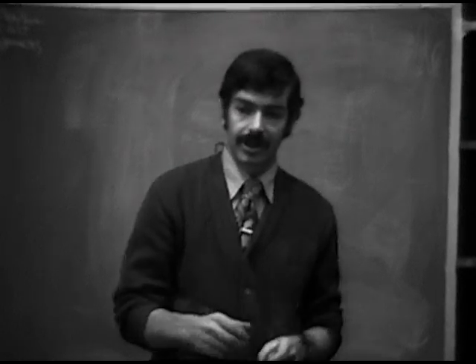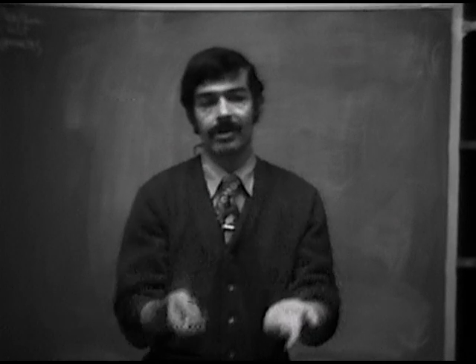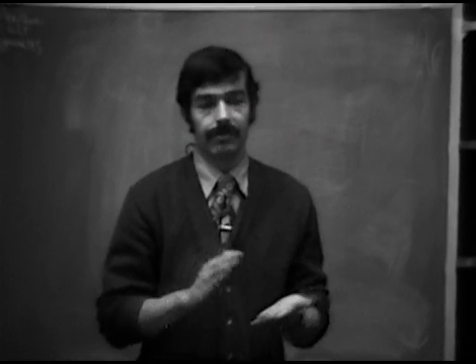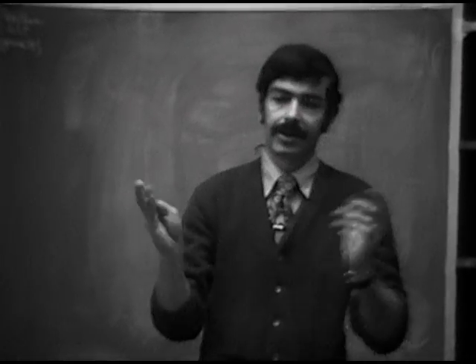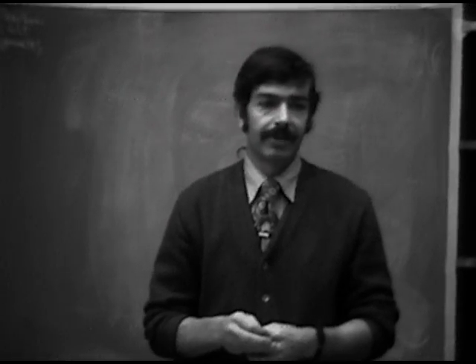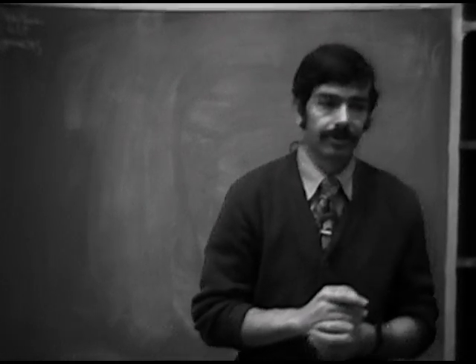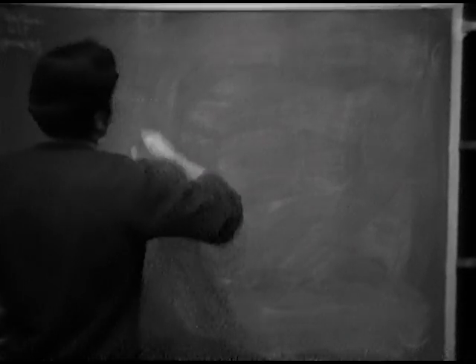Whereas if they would just take the time and go through a routine that we're going to describe, things would automatically pop out at them, and they would have a diagnosis. Also, other people have a tendency to see an inferior MI and then throw the tracing away, and they forget about noticing the first-degree block and other things, which can be extremely important. So for many reasons, it's important that we develop a routine.